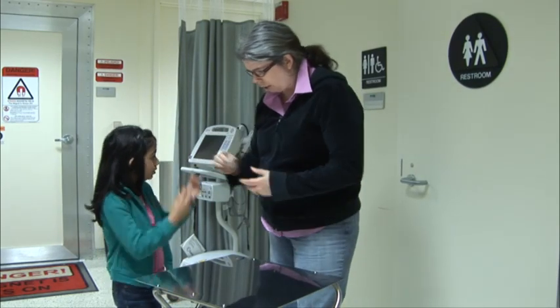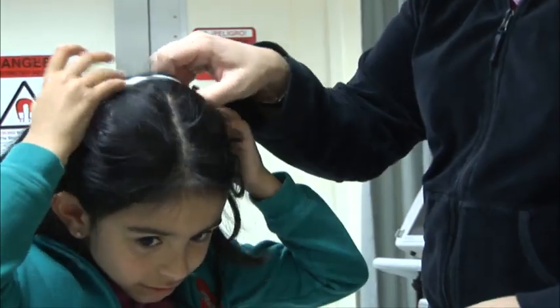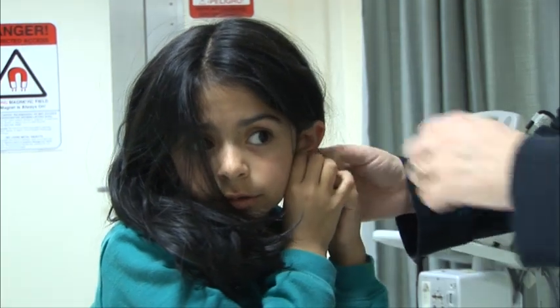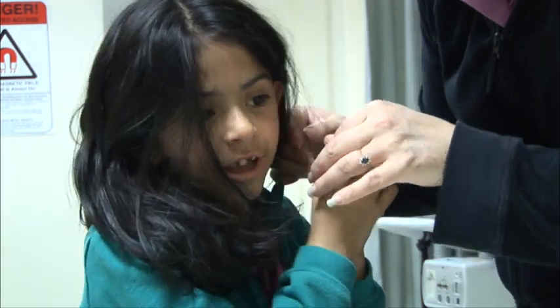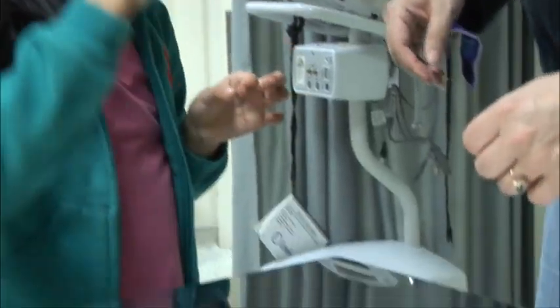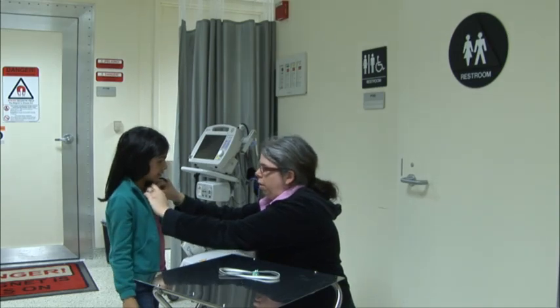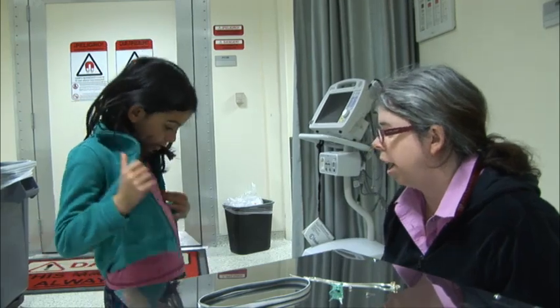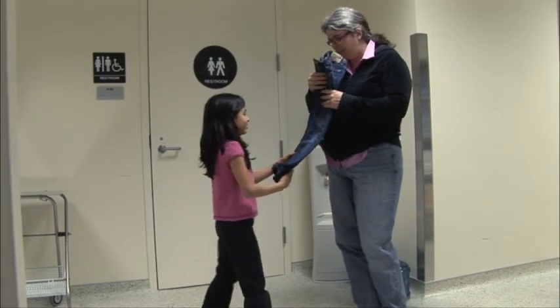Since the scanner is a big magnet, nothing with metal can be taken into the scanner room. You'll fill out a metal screening form with the help of your caregiver to make sure that you don't have any metal on or in your body. You'll take off your jewelry, belts, hair elastics, wallets, coins, keys, and anything else that might contain metal. It's best if you leave your special things like jewelry at home. We'll make sure you can store anything you have with you in a safe place like a locker. Be sure to give the locker key to the researcher before you go into the scanner room.